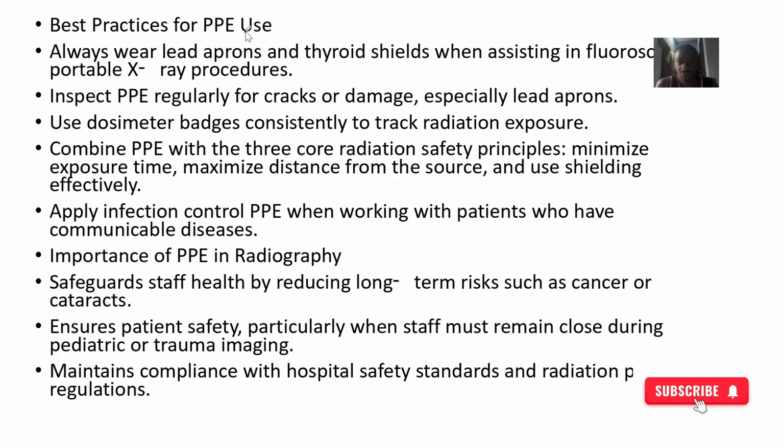Best practice for PPE use is to always wear aprons and thyroid shields when assisting in anything fluoroscopy or portable X-rays. Inspect the PPEs very well, because you don't want to see any cracks that radiation could still go through. Then use dosimeter badges consistently for tracking exposure.